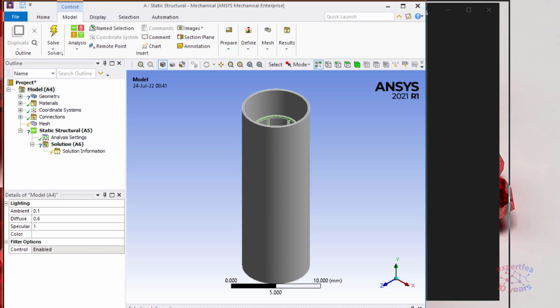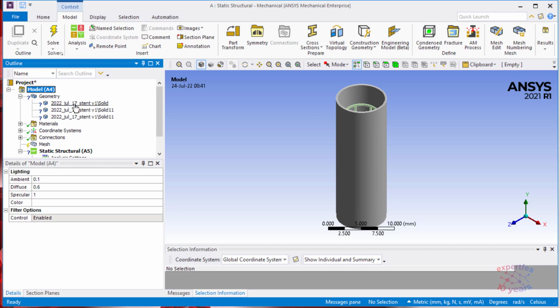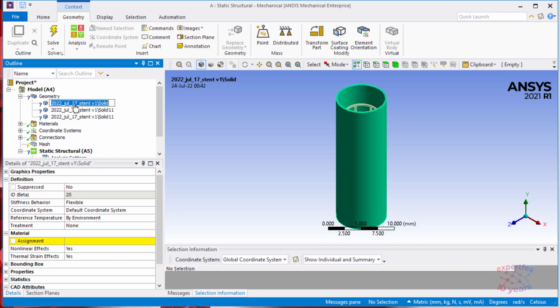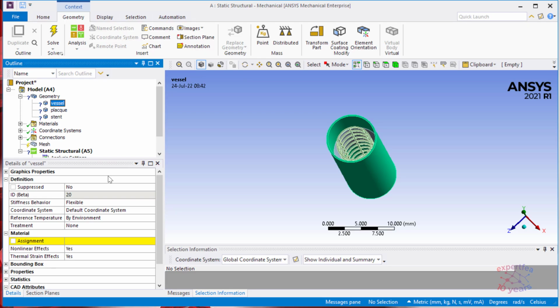So this just opened. Firstly, let's name the parts as needed. This is the vessel. Inside we have the plaque and also the stent. Let's assign the proper materials.